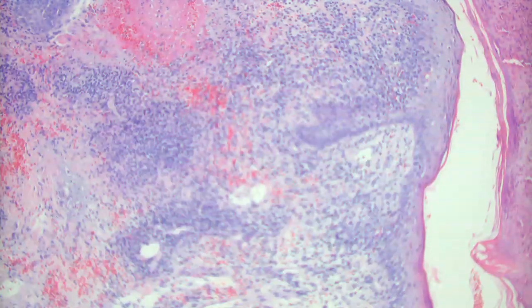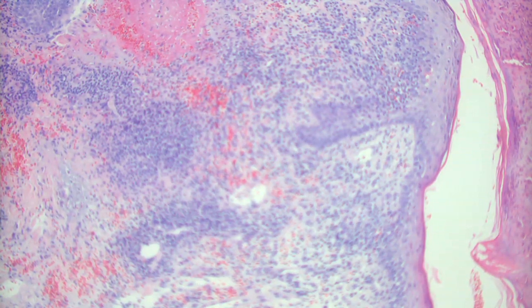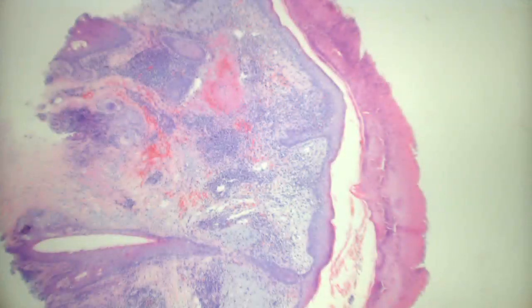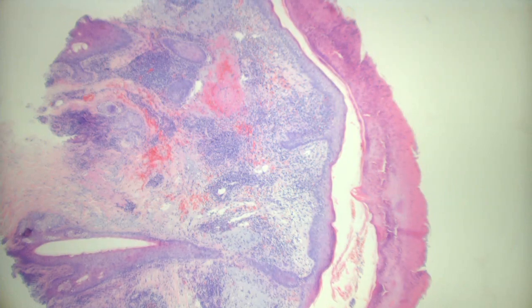If you biopsy, this is what it looks like sometimes. And everybody says, oh, that stuff on the left, that could be lupus. Well, notice that it's got some little papules and maybe even a pustule or two. So don't overcall rosacea as LE. You would never do that, I know.